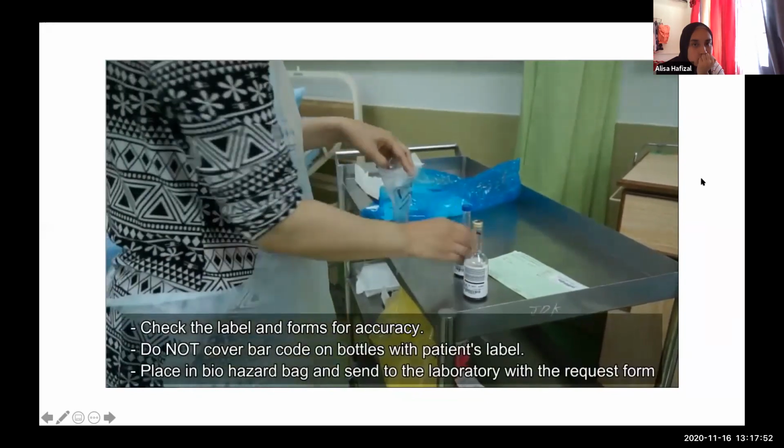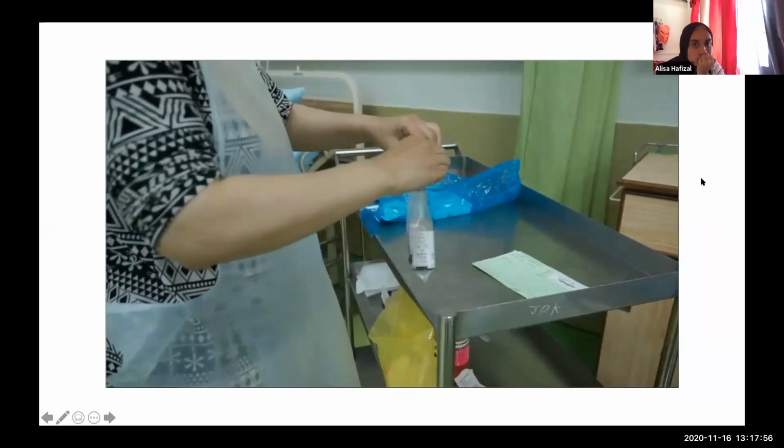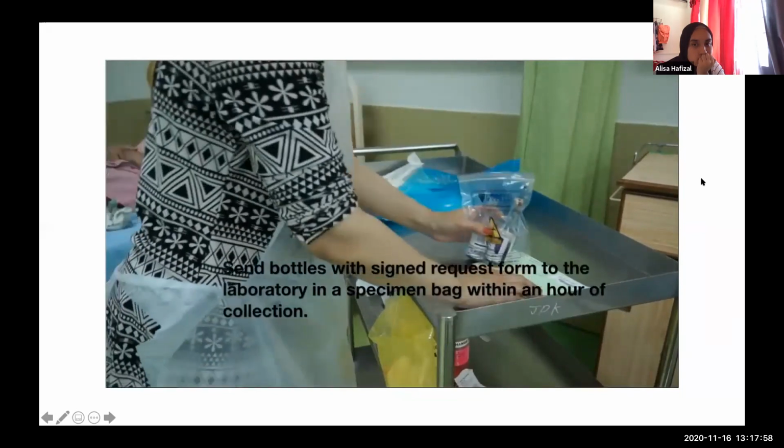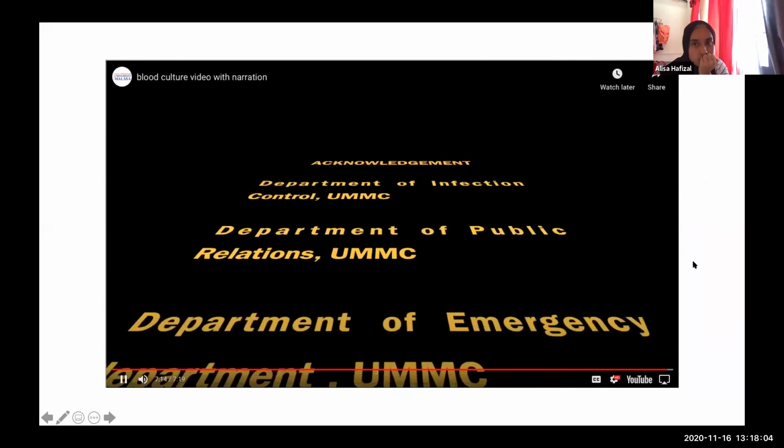Document the patient's identification, date and time of collection, and site of collection on the culture bottle without obscuring the barcode. Send bottles with a signed request form to the lab in a specimen bag within an hour of collection.